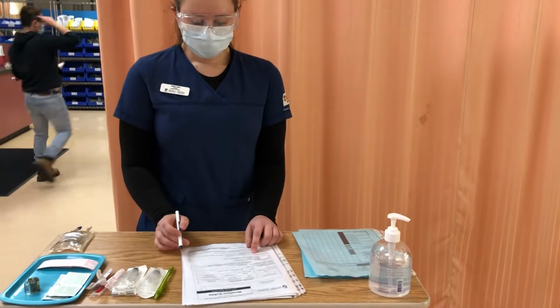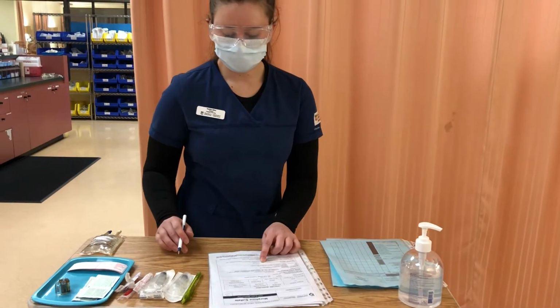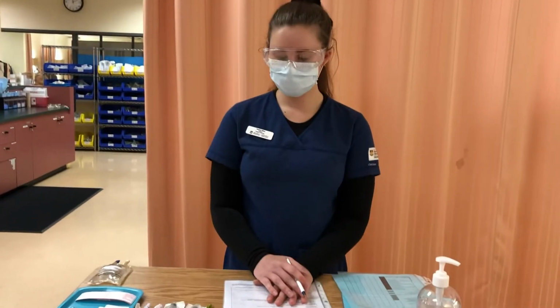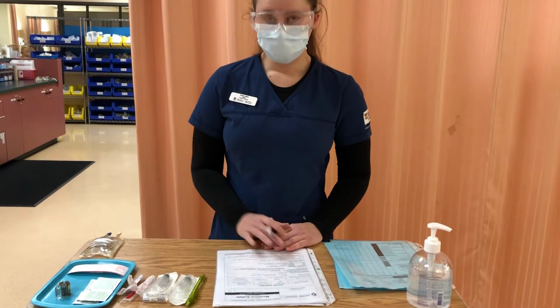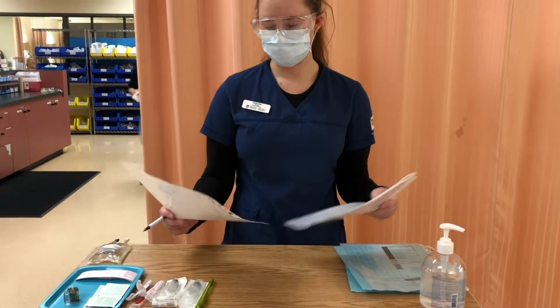I have monitored my patient's baseline pain, their pain relief, as well as their baseline respiratory and mental status and their baseline vitals, specifically their blood pressure. So I will be checking their vitals, respiratory and mental status very frequently while they are on the medication to keep an eye out for any of those hazards that I previously listed.